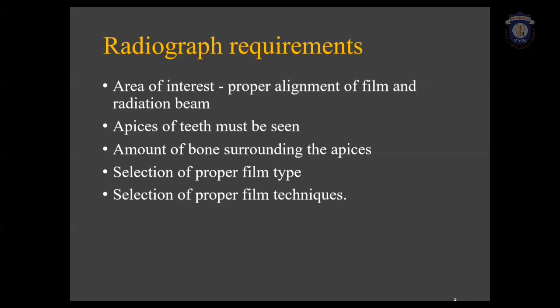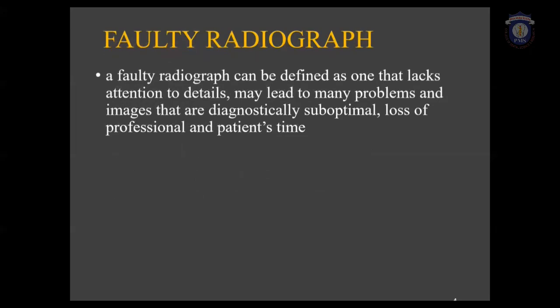So, moving on, now we will see what a faulty radiograph is. Based on these findings, we can define a faulty radiograph as one that lacks attention to detail. It can lead to many problems. The images are diagnostically suboptimal, therefore causing a loss of professional and patient's time.